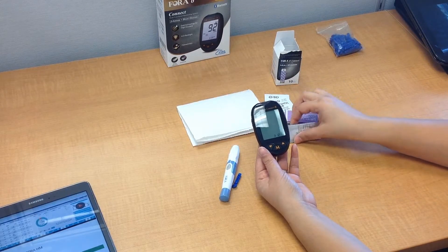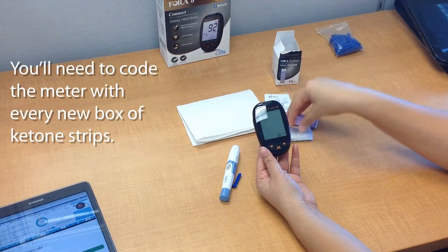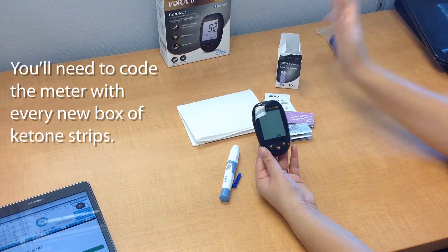You don't have to code it again as long as you're using the same code strips. Once you finish these strips and buy a whole new box, you'll have a whole new coding strip and will need to recode.